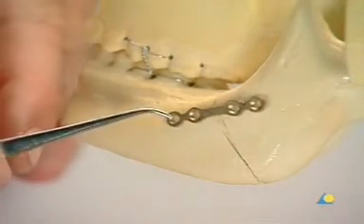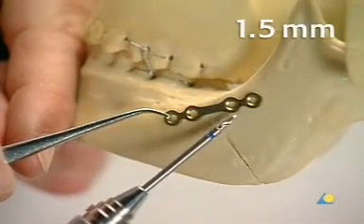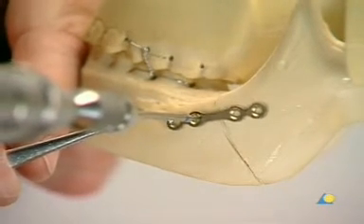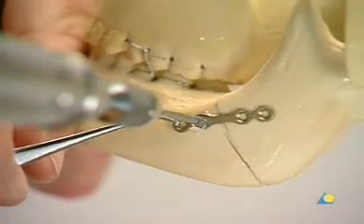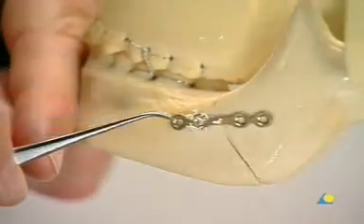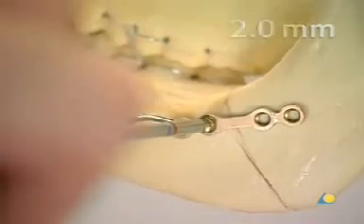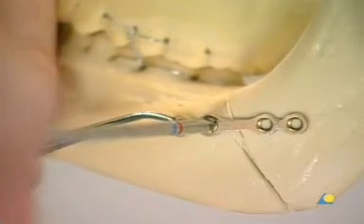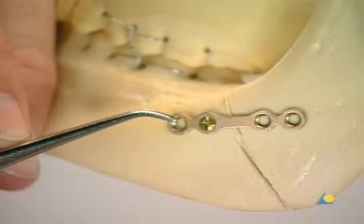The first hole is drilled monocortically, close to the fracture, using the 1.5 millimeter drill bit with a 6 millimeter stop. Use of this drill reduces the risk of damage to tooth roots and the inferior alveolar nerve. A 6 millimeter long, 2 millimeter screw is now inserted, but not fully tightened, so that the plate can still be adjusted. Sometimes it's useful to insert the first screw into the proximal segment first, so that the plate can be used to reduce the condyle bearing fragment.